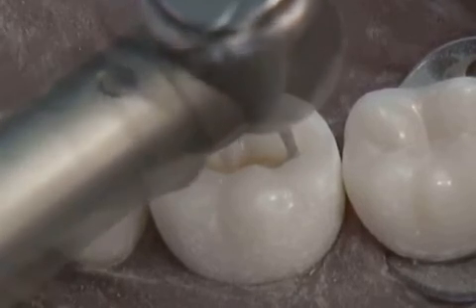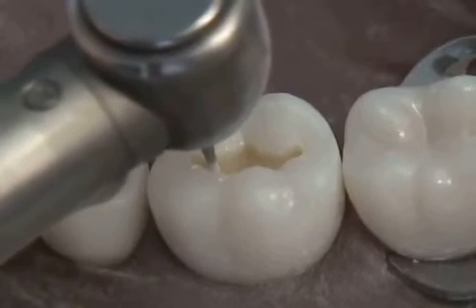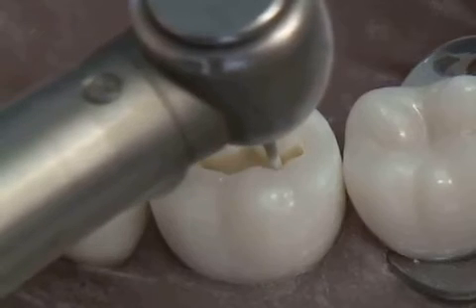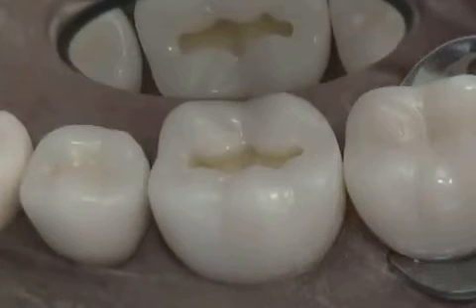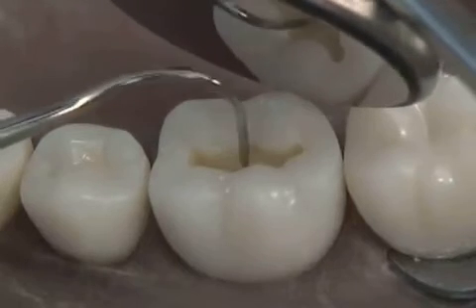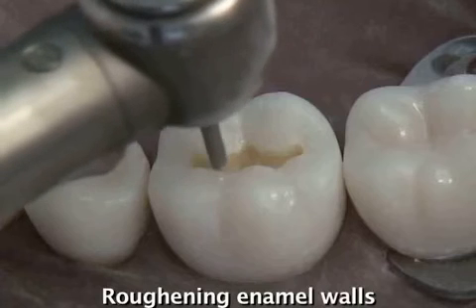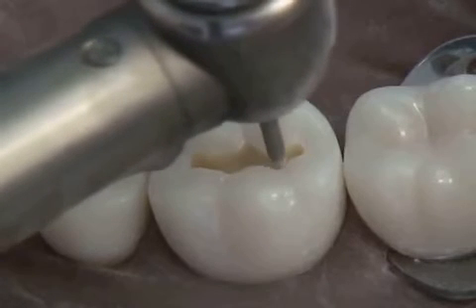Extend mesial and distal along the natural grooves of the tooth to incorporate the extent of disease until you reach sound tooth structure at the perimeter of your preparation. Check to see that you created smooth, convergent walls with a mirror to give you the best view. You can confirm the absence of caries at the base and sides of your preparation with an explorer.